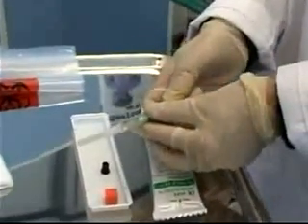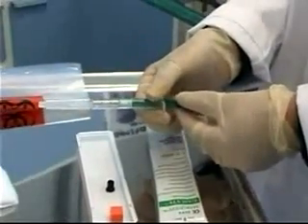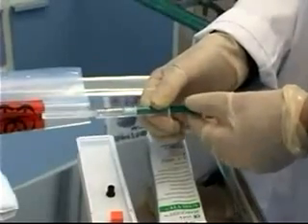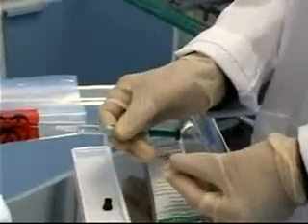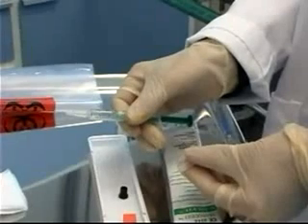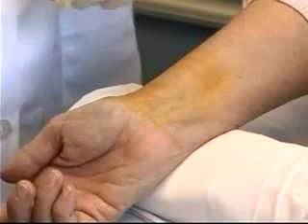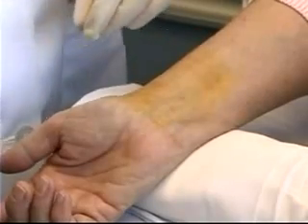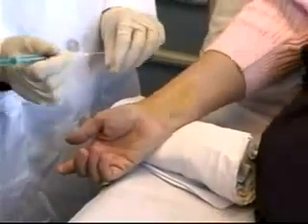Pull back slightly on the plunger so that once the needle is in the artery, the pulsations from the artery will be able to push back and fill the syringe. Slide the cap off the needle and make sure you can see the bevel, so you know to go in bevel-up when inserting through the skin. Hold the syringe at a sharper angle, closer to 45 degrees, much like holding a dart or a pen.